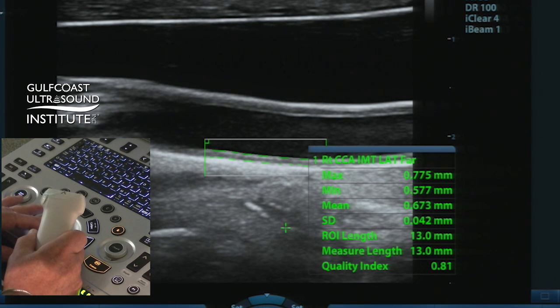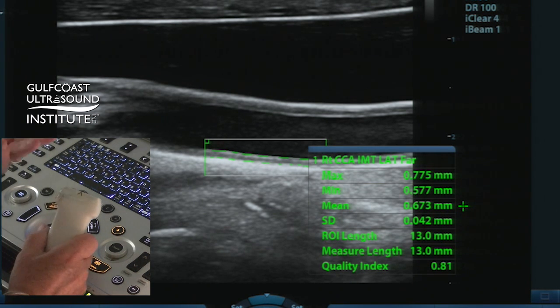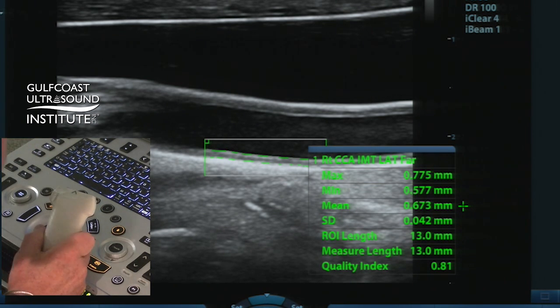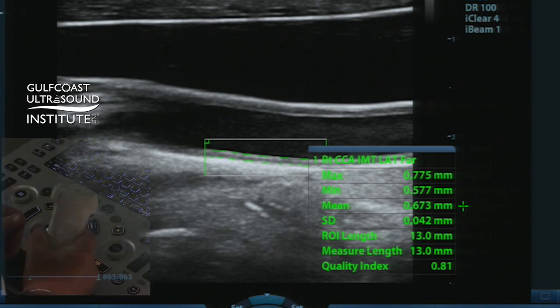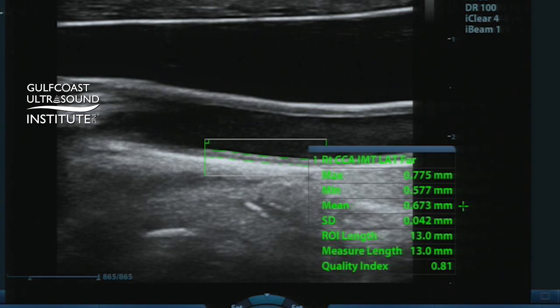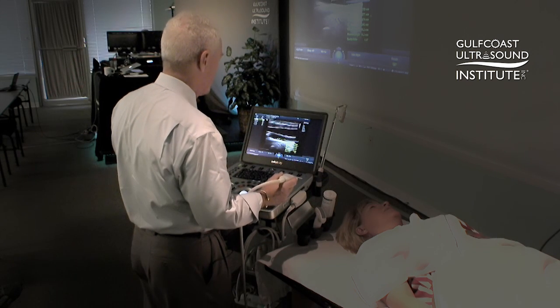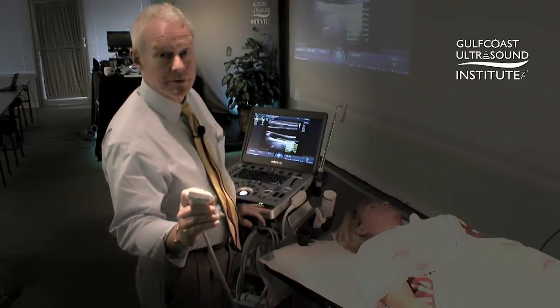So again, a high quality index and reliable data, and it's as simple as that. You would do this on the right side, do this on the left side, compare the two, and then you would have a mean and a maximum intima-media thickness that you could put in the patient's chart and use to help guide management for avoiding and preventing cardiovascular disease. It is a very straightforward, simple process.